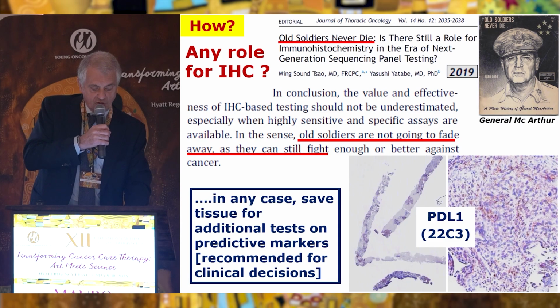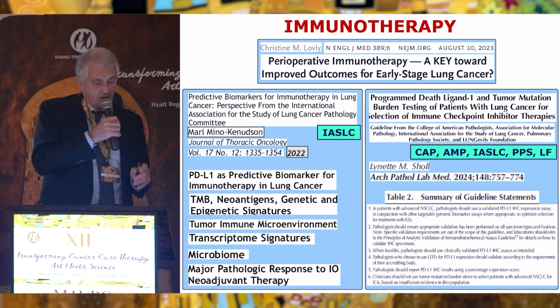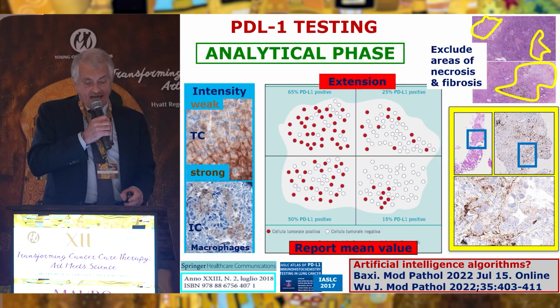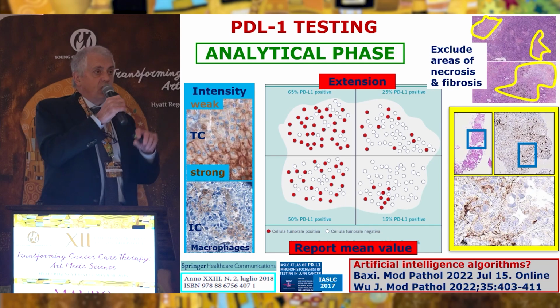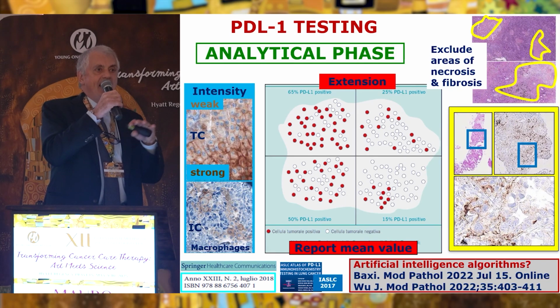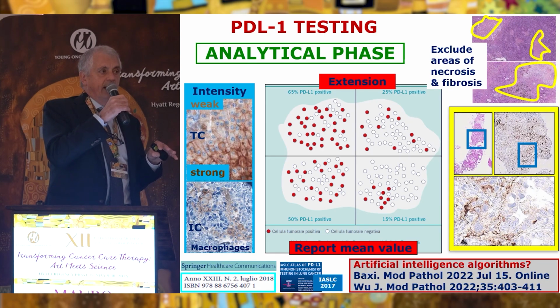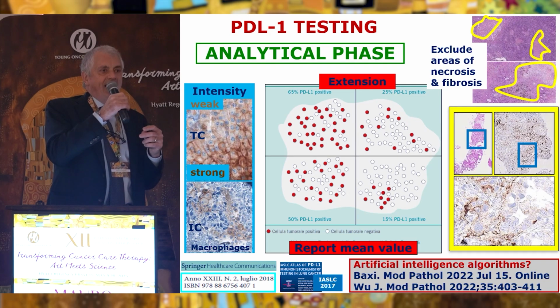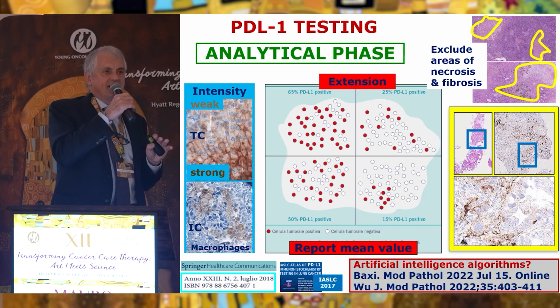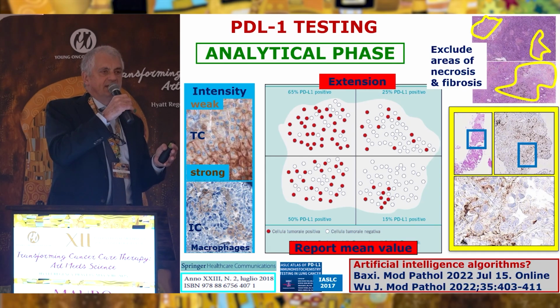The same holds true for immunohistochemistry. I already presented it last year, and we still go ahead with some immunohistochemistry in order to predict the expression of ALK, ROS1, and a few others. In the end of molecular tests, we include PD-L1 because PD-L1 is very popular and is going to be expanded in many other areas out of the thoracic area, although the need of the pathological assessment of PD-L1 is not the rule. Some cases do not need PD-L1 assessment by pathologists for deciding the treatment.